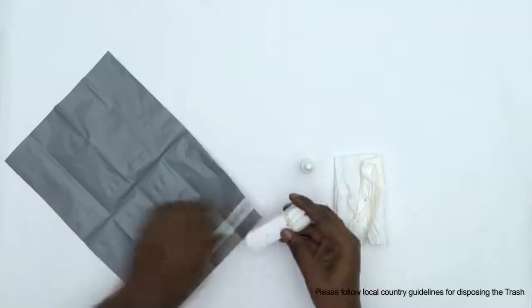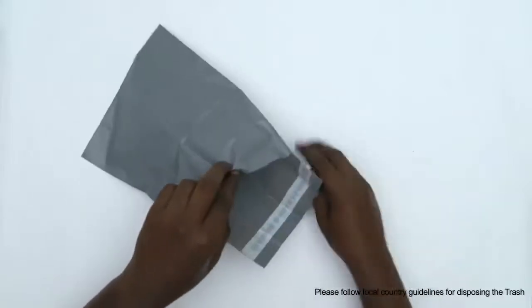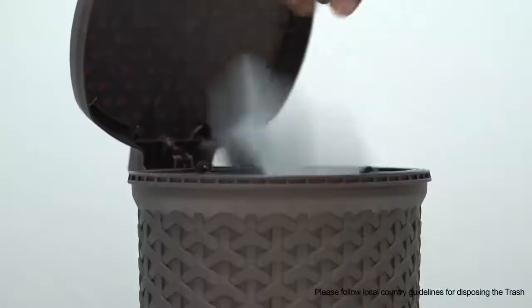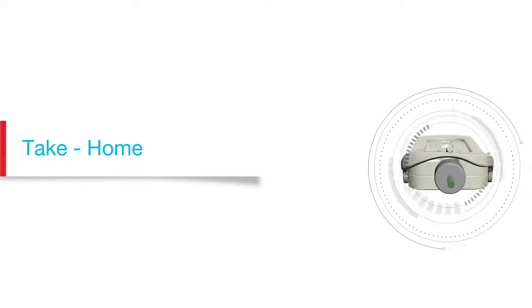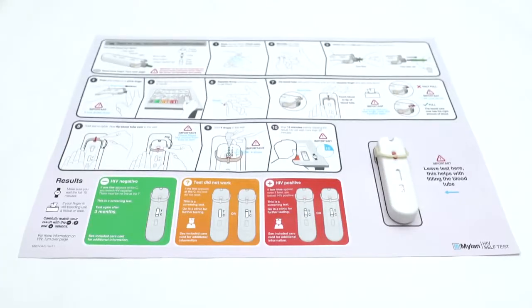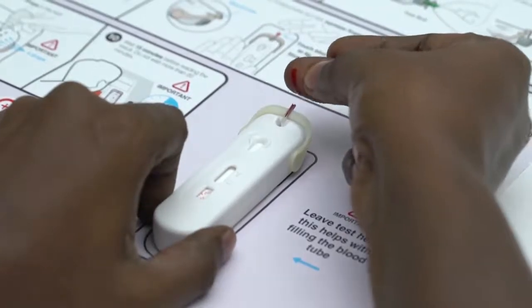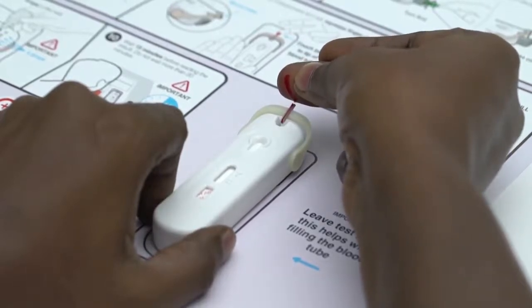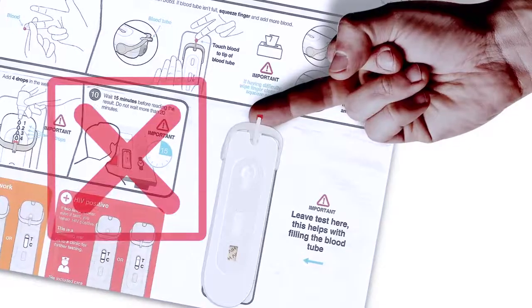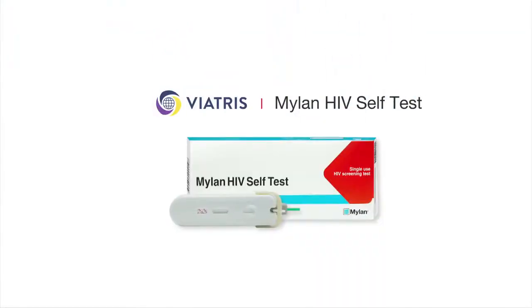Now that the test is finished, you can dispose of it by putting all the test materials in the plastic bag provided and placing it in a rubbish bin. We hope that this video was helpful to screen yourself with the Mylan HIV self-test.